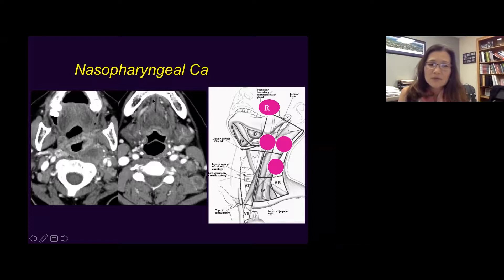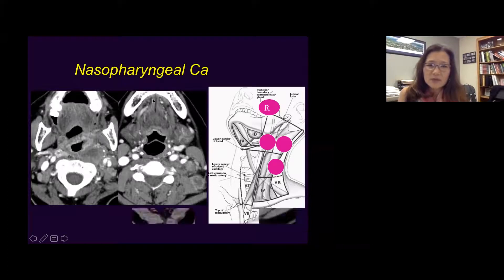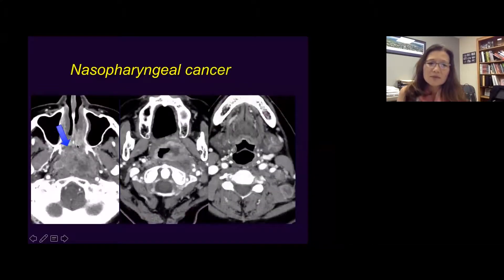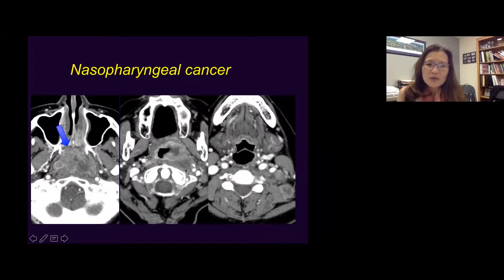This is nasopharyngeal carcinoma. Another different patient with a large nasopharyngeal carcinoma filling the entire nasopharynx — notice there's oropharyngeal extension, but again retropharyngeal lymph nodes with level 2 and level 5 zone metastasis.